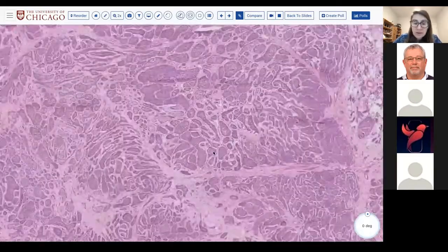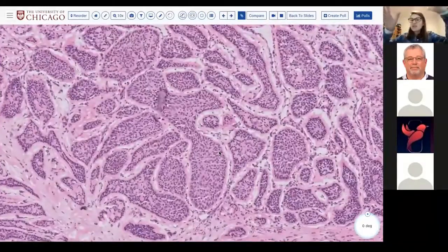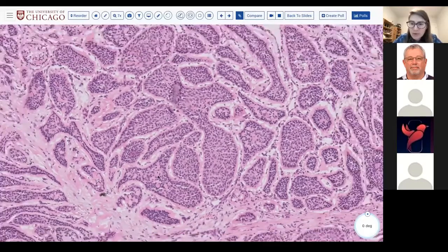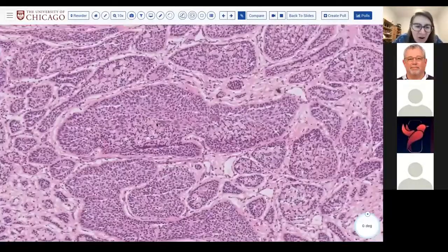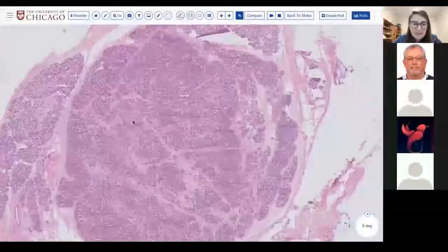Also shows this sort of tubulotrabecular, perhaps now moving into a so-called membranous pattern, meaning like this jigsaw puzzle, where you almost start to look like a cylindroma of the skin, where you again see these hyaline eosinophilic stromal globules. And one thing I will point out is that your cytomorphology is still arguably bland, still ovoid, not hyperchromatic, not mitotically active, all right? So probably still something low grade.